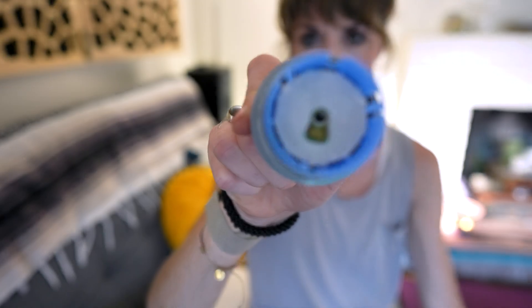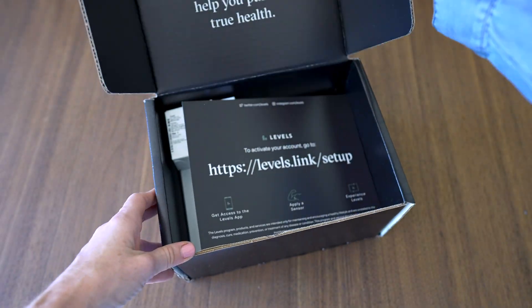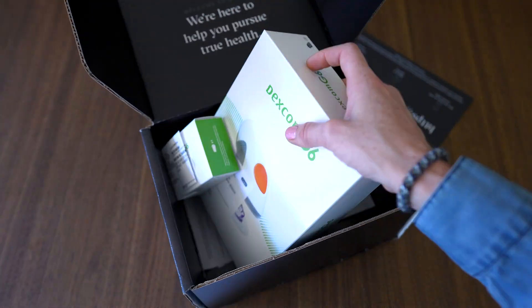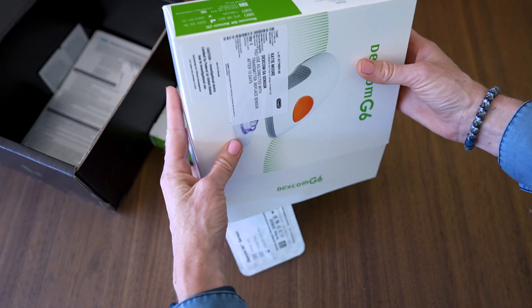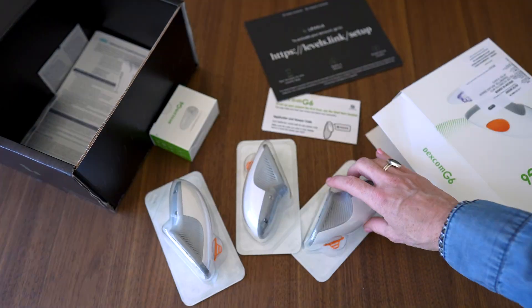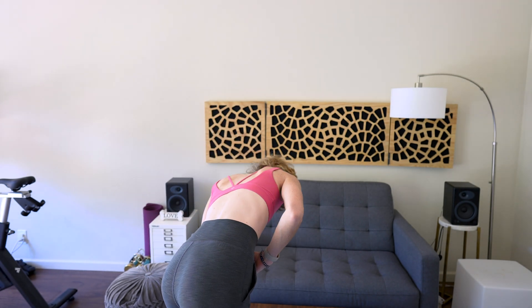And of course, how it compares to wearing the Freestyle Libre on all things like accuracy and comfort. Yes, I did wear both sensors at the same time. And yes, I did get a lot of strange looks at the gym. So in this video, we're going to go over all the information you need to know about the Dexcom before getting started, including a little bit of my own saga and experience, and a string of kind of stupid mistakes I made and how you can avoid them.